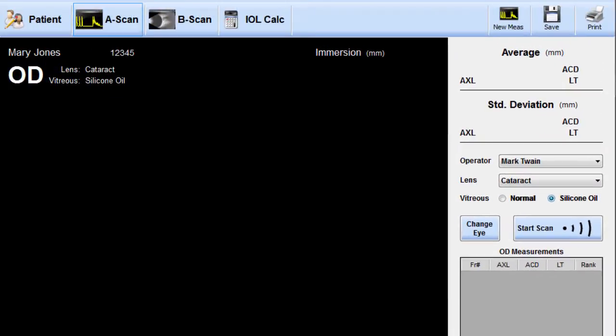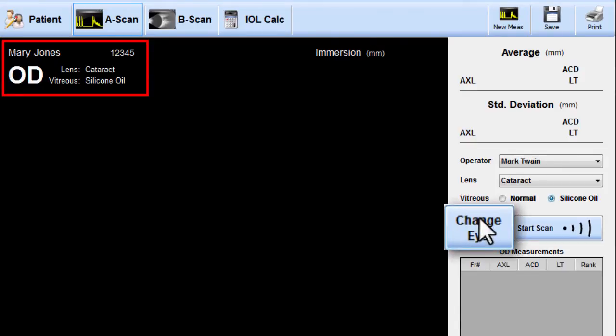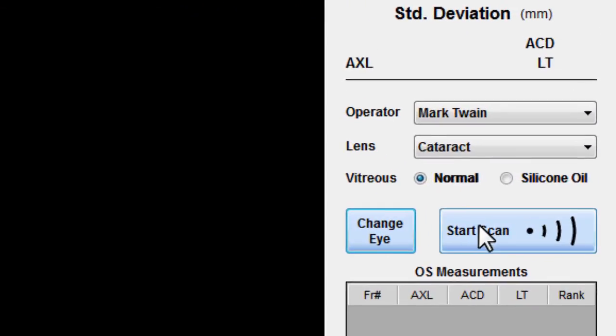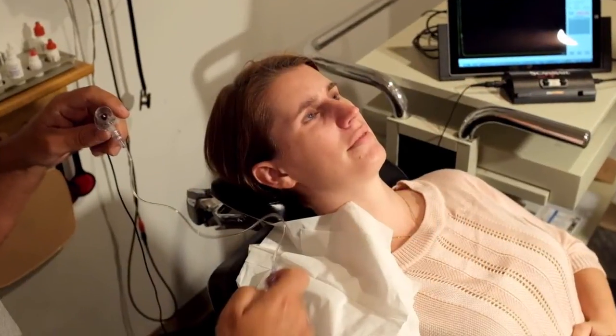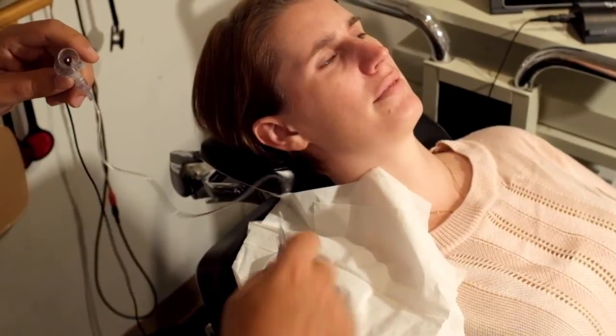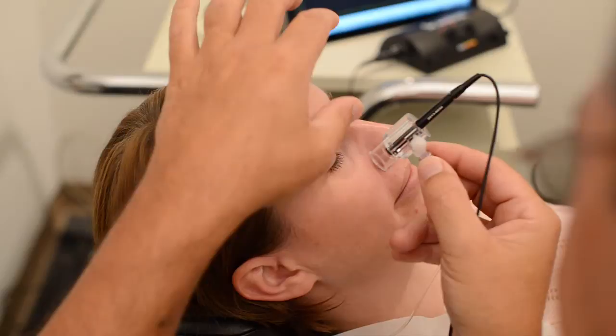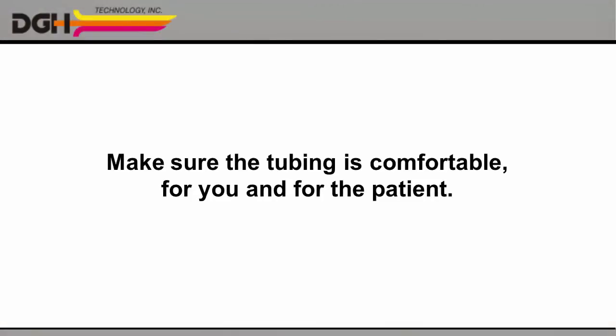The details you've chosen will appear at the top of the screen. Please make sure they're correct. Click the Change I button to select OD or OS. And when you're ready, click Start Scan. Now, place a towel on the patient's shoulder along with a saline reservoir. Hold the probe and shell in your hand and make sure the tubing is comfortable for you and for your patient.